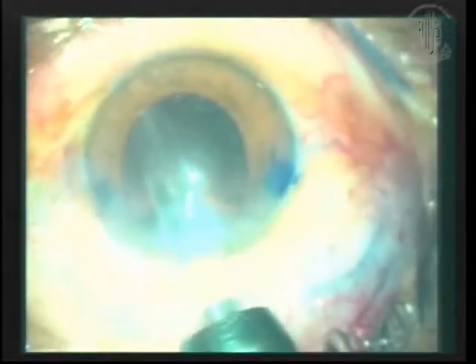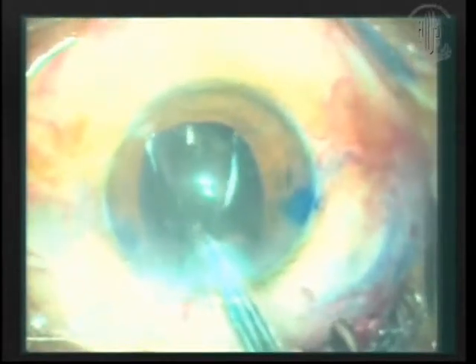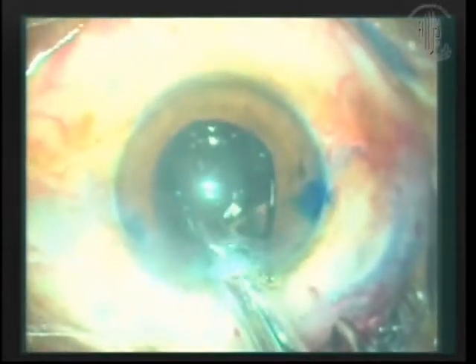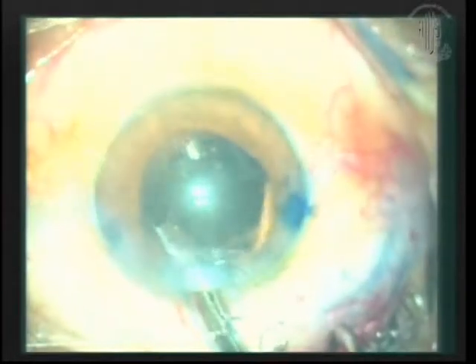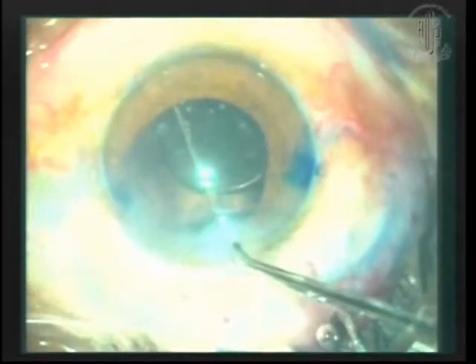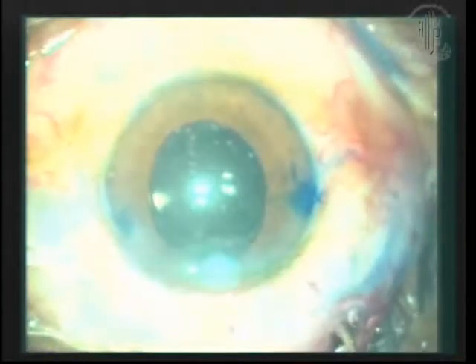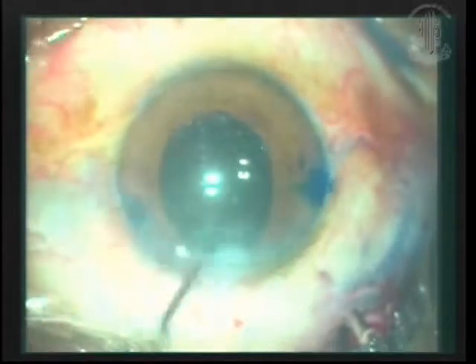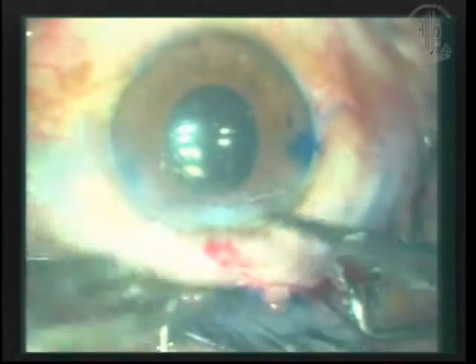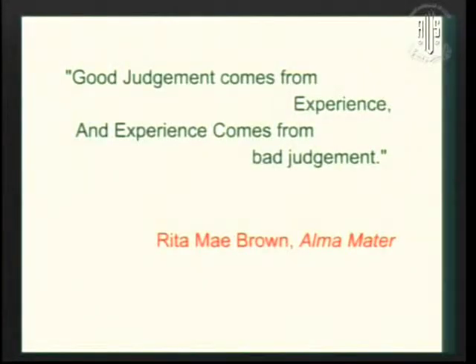I put in a lens. It's still a heroic surgery because I managed to put a lens into the sulcus over the rexis rim. And I was very happy with the centration of the lens, very stable lens, no issues. But this wound burn was going to be nightmarish. So there we are. It goes in perfectly, centered, dialed. So that means our rexis rim is fairly intact except for that tear over there. Now I had to put two sutures over here. I had very little choice. That gave me an awful astigmatism, which I regret till date. So, good judgment comes from experience, and unfortunately, experience comes from bad judgment, like we saw.